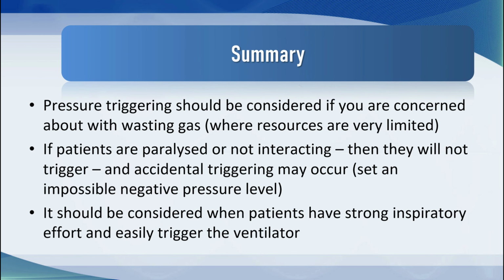In summary, pressure triggering should be considered if you're concerned about wasting gas where resources are very limited. If patients are paralyzed or not interacting, they will not trigger, and accidental triggering can occur. And so it's important to set an impossible negative pressure level on these patients, because really, really sick people, the last thing you need is the ventilator triggering itself.